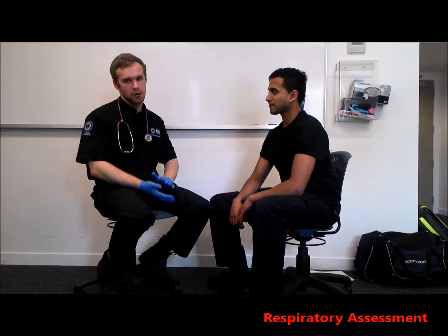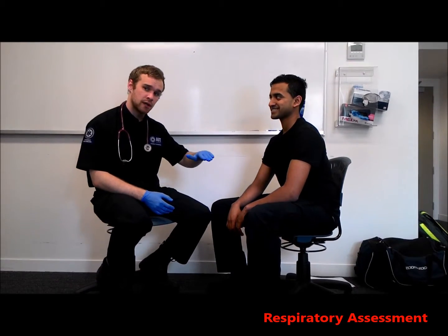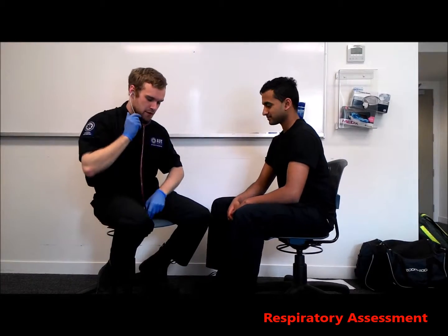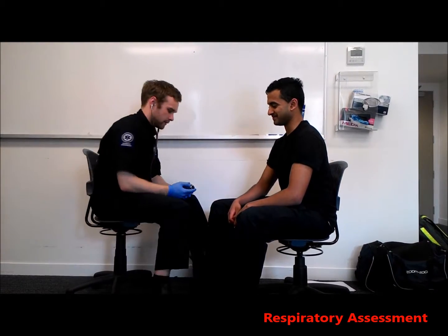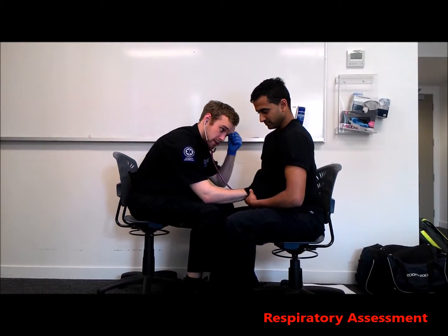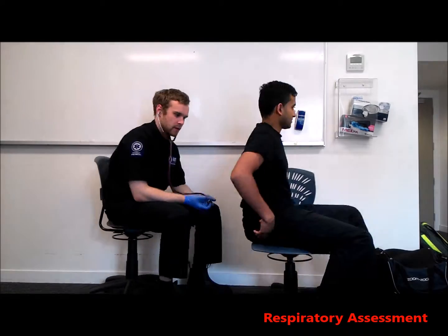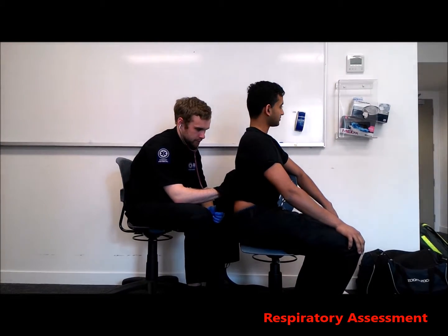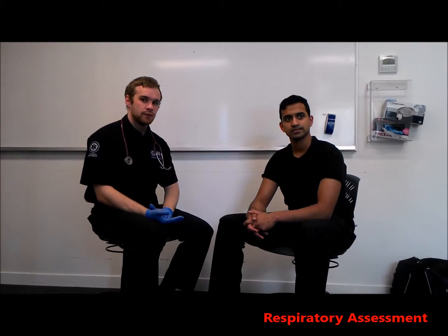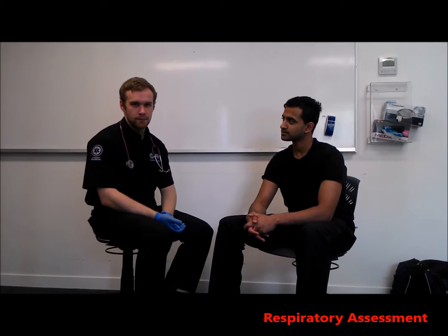So next we're going to use a stethoscope to auscultate at the mid-axillary line, which is at the base of the lungs, anteriorly and posteriorly. So Dave, I'm just going to reach up under your shirt with my stethoscope. Alright? Yes. And can I get you to breathe in deeply twice? Using the stethoscope, what you're actually listening out for is the clarity and integrity of the lungs, making sure there's a good tidal volume coming into the lungs.